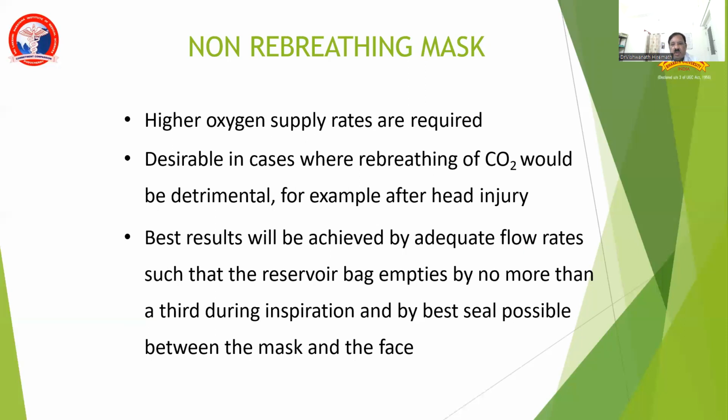Best results will be achieved by adequate flow rates, 15 liters per minute, such that the reservoir bag empties by no more than a third during inspiration, and by the best seal possible between the mask and the patient.